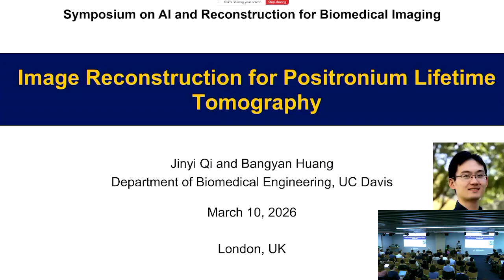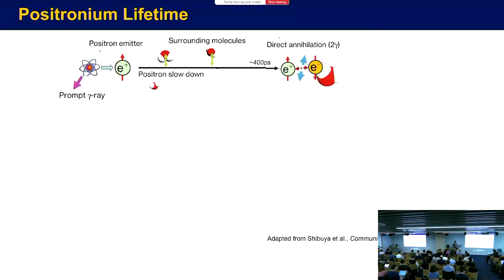We have been focused on developing a new imaging technology for positronium lifetime imaging. I know many of you may not be aware of this, and a few years ago I wasn't aware of this either. So I have learned quite a lot in the last few years about positron annihilation.